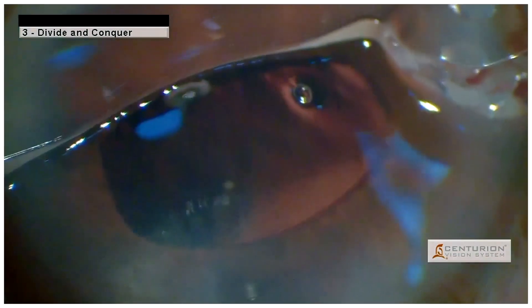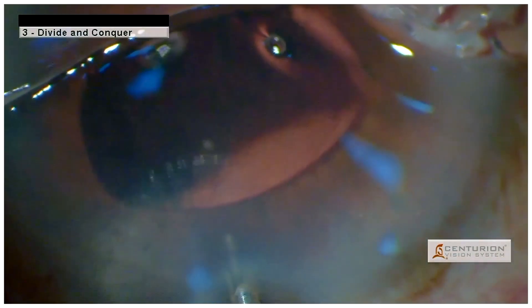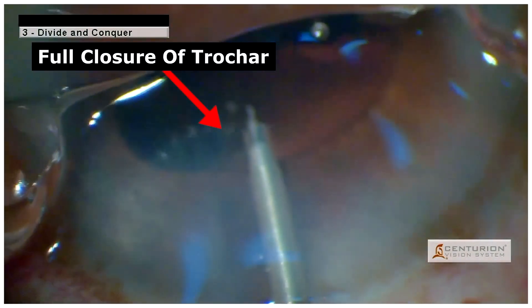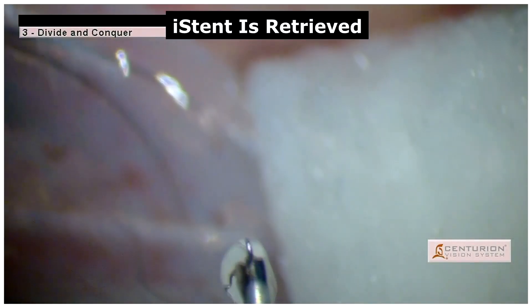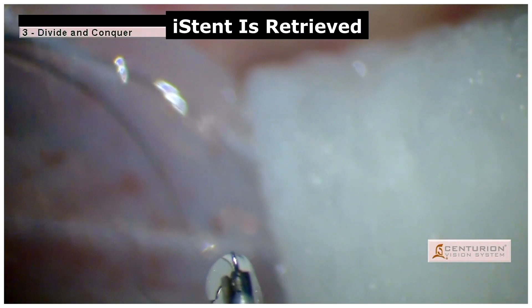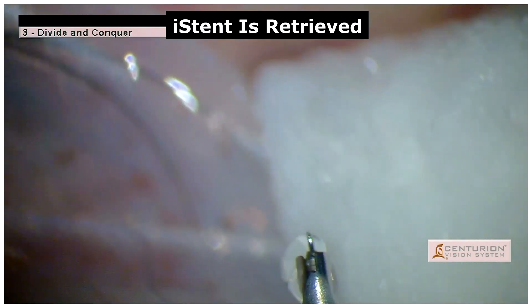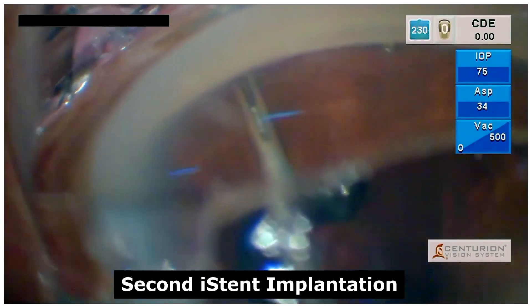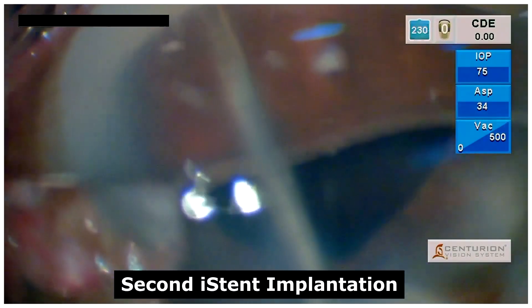Again, a re-attempt at retrieval was done by re-threading the iStent into the trocar. This time, there was complete closure of the trocar by the sleeve before removing it out of the eye, and here we can see the re-threaded iStent in the trocar. Following which, the second implantation of the iStent was done with proper dimpling technique, ensuring the iStent was well placed within the trabecular meshwork.